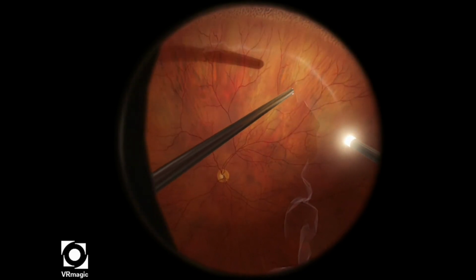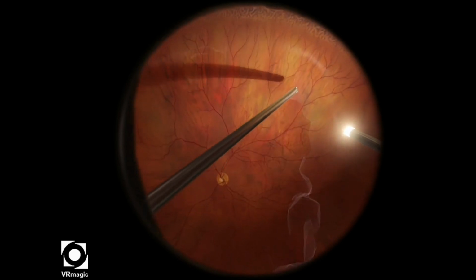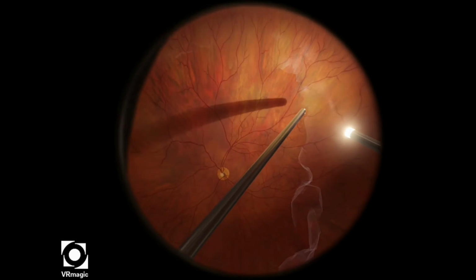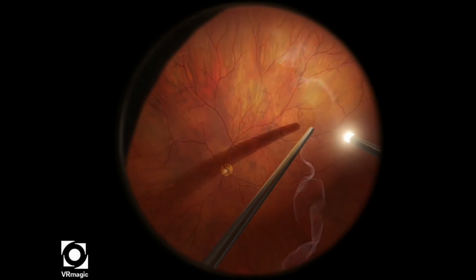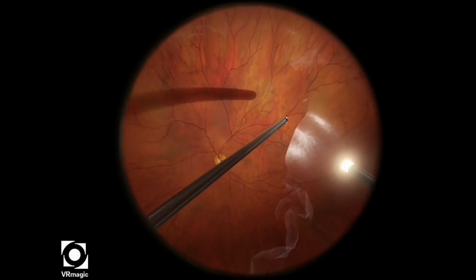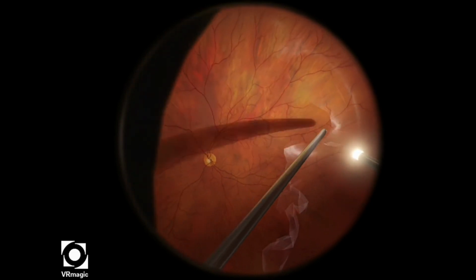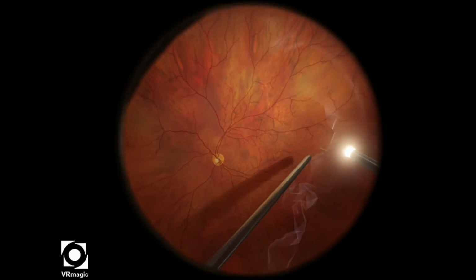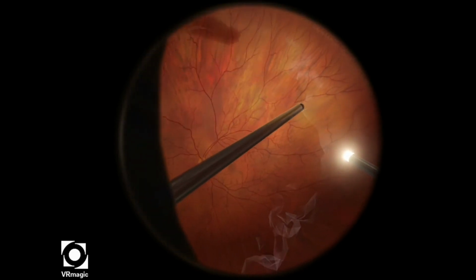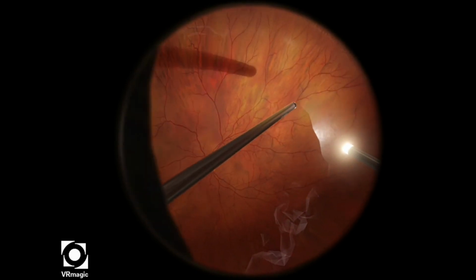So again, try to be mindful of the posterior capsule. Here I am reaching across. I do know where the limits are, but many different times I have touched the posterior capsule and lowered my score significantly. But you want to try to tilt the eye if you can. That way you're able to cut more of the vitreous out. Again, trying to pull, and then get more of the vitreous and cut more.